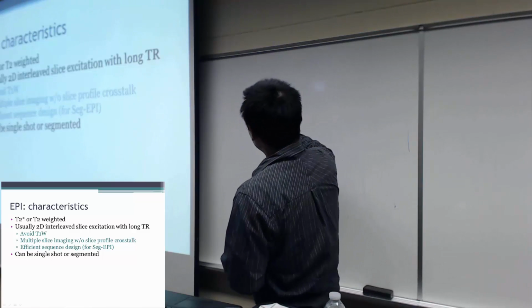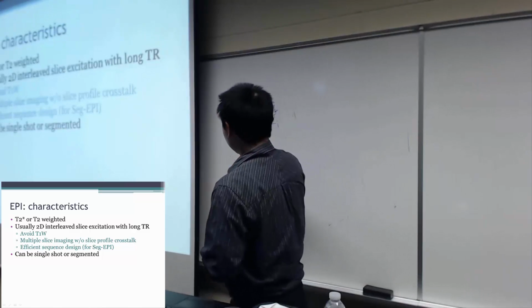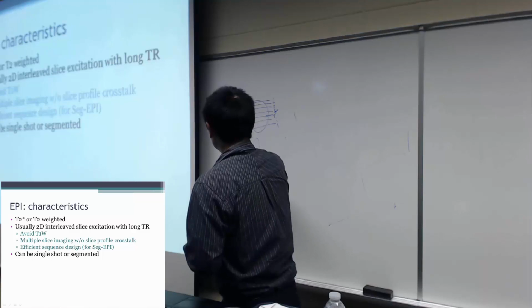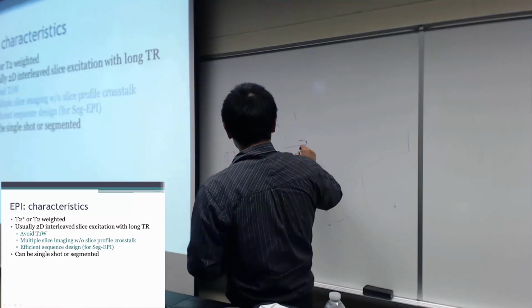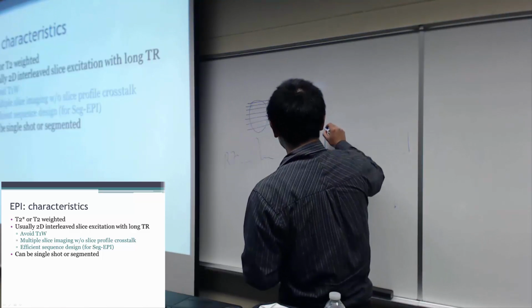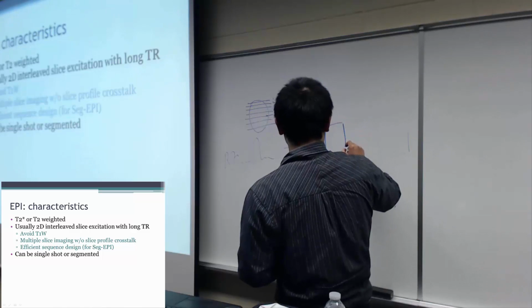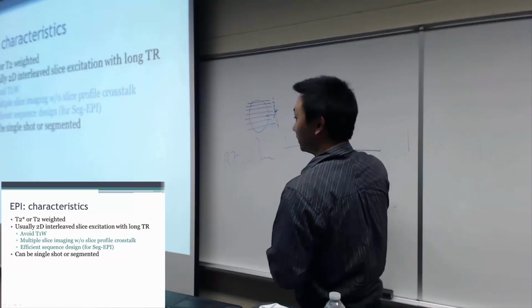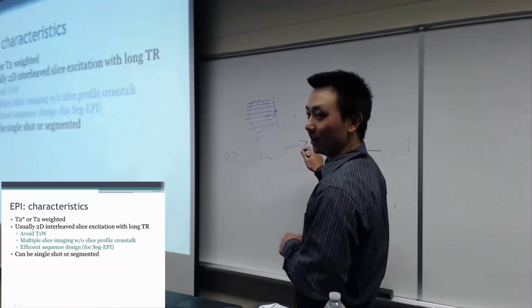If we use an RF pulse, we hope to get an ideal slice profile, which is a rectangle.